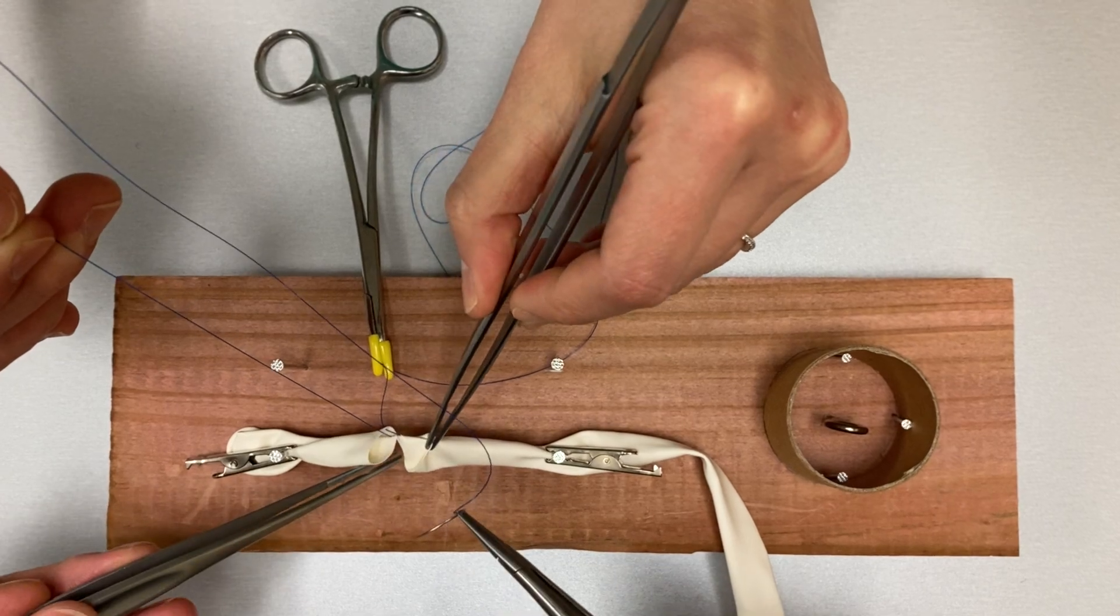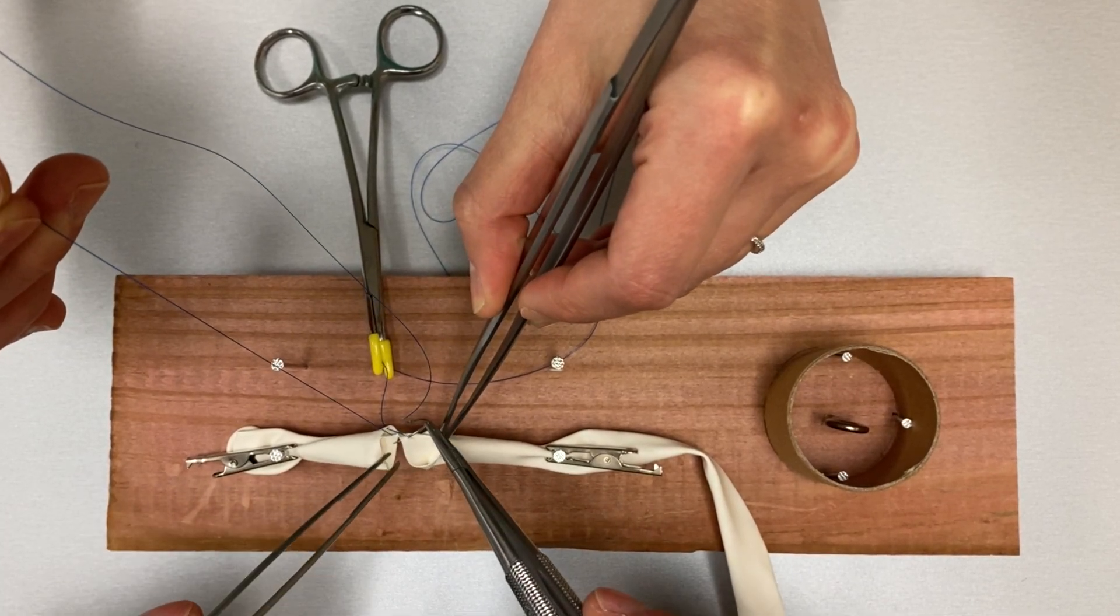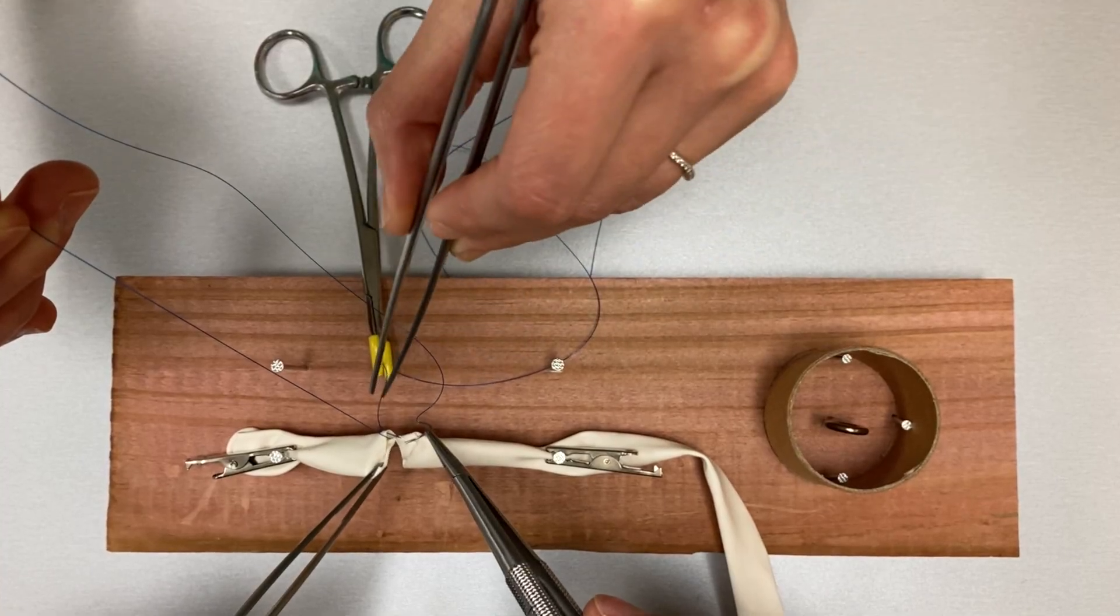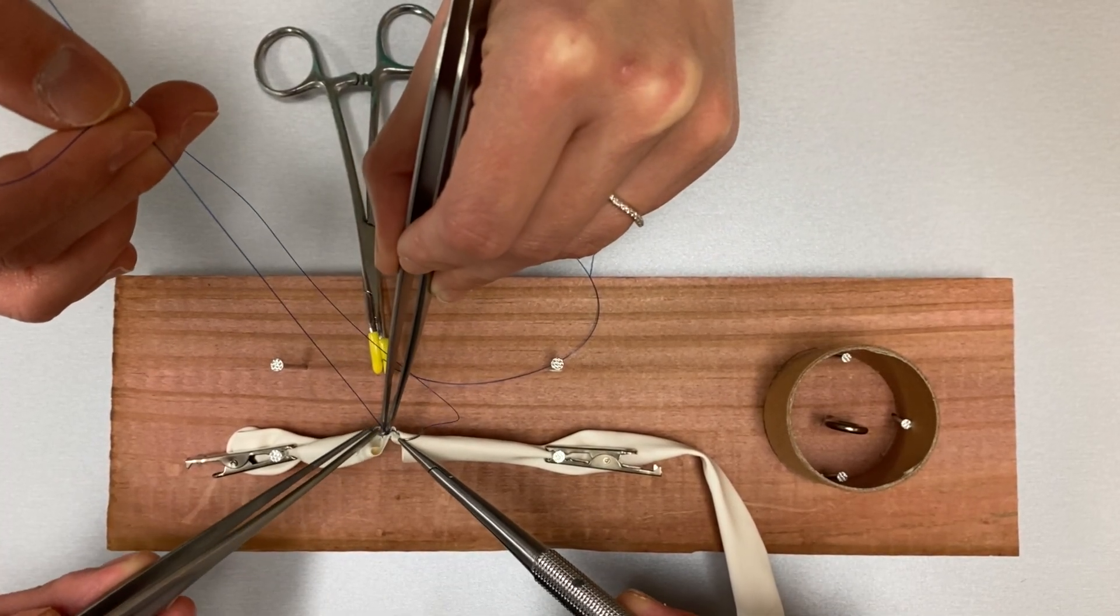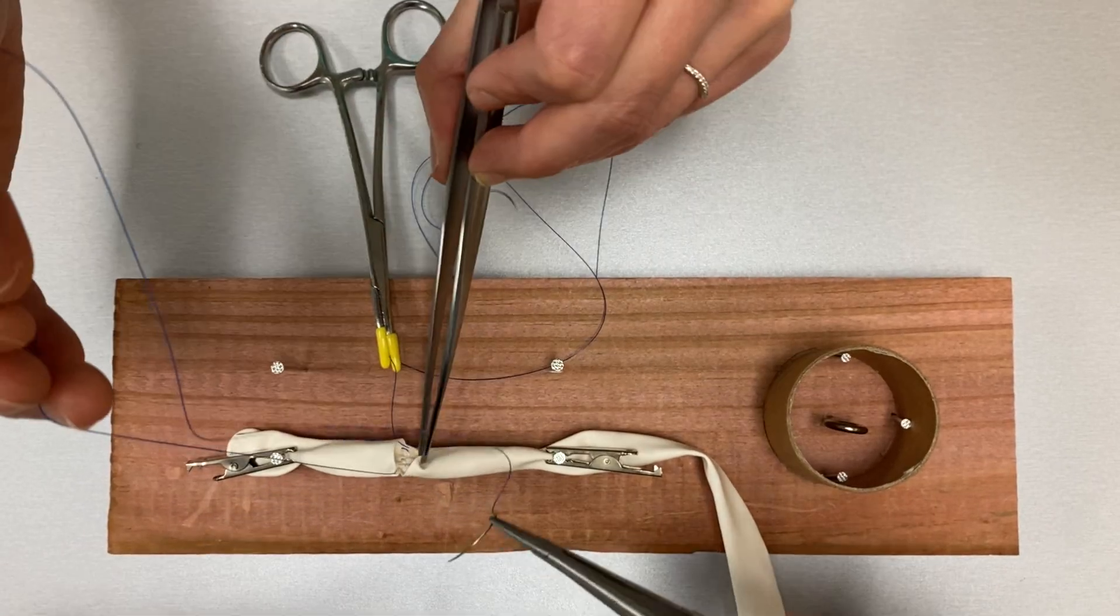You will notice we are using a pitch and catch technique where the needle driver passes the needle to the pickups prior to releasing. This allows for better control when sewing on moving tissues like the heart.